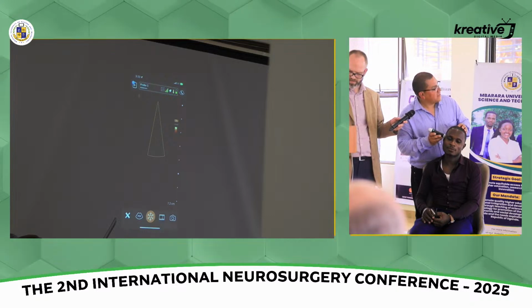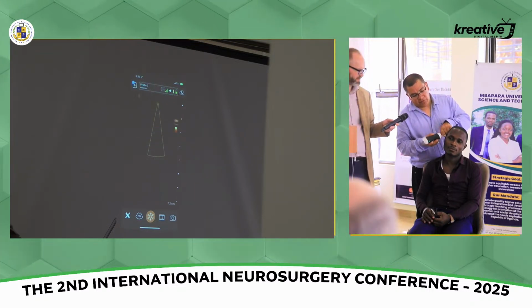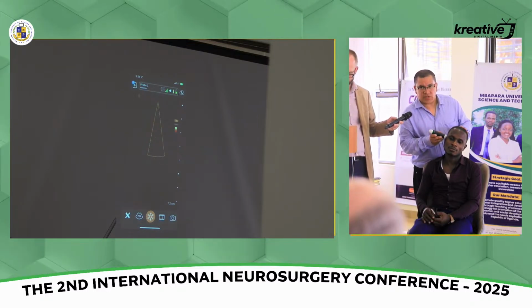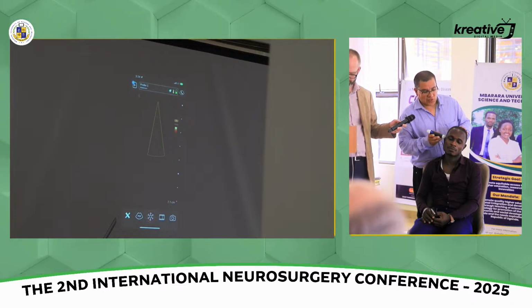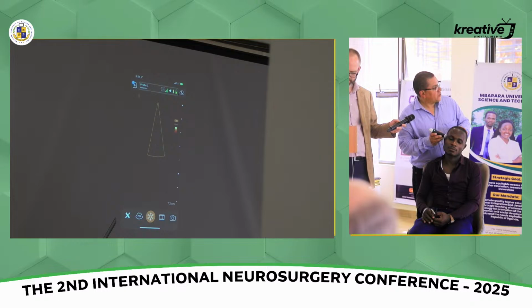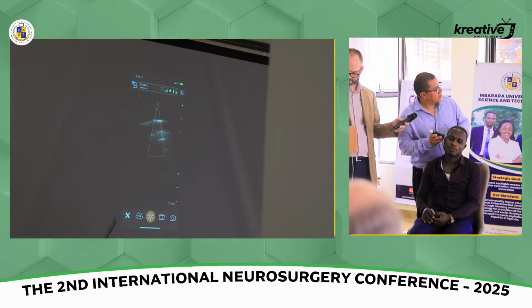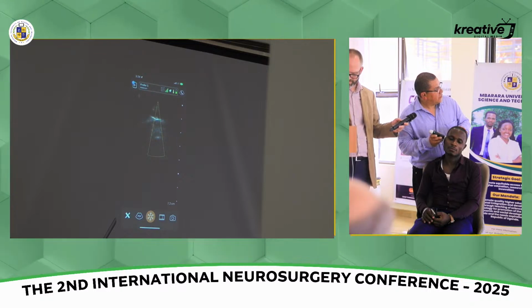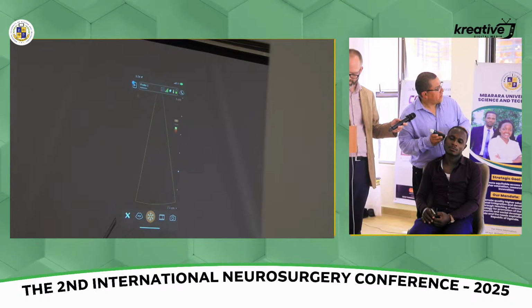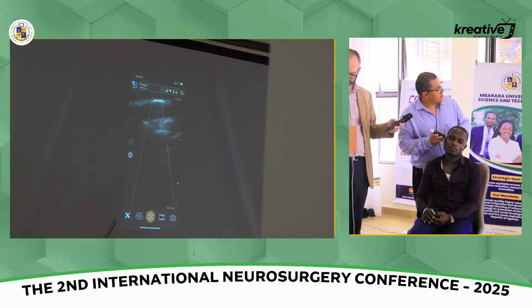But this is basically the procedure that you use. You locate your temporal window right here. It's right in front of your ear, and you just start. It takes a lot of patience, and it's actually operator dependent. So maybe not a good operator right now, or it's just the technology. The probes that we use are usually smaller than this one, but this is essentially what you should do until you find a blood vessel, and you can have the color Doppler in there and measure the velocities.